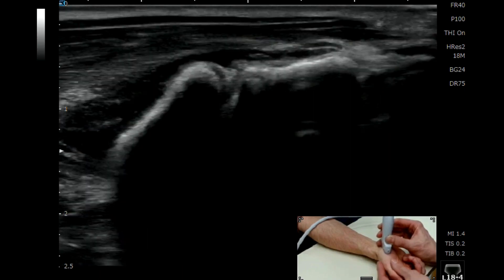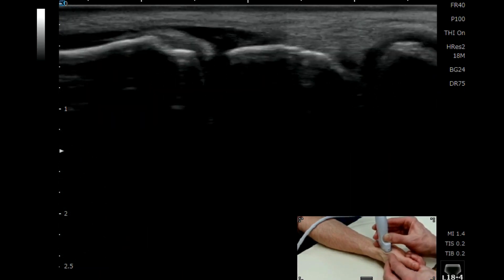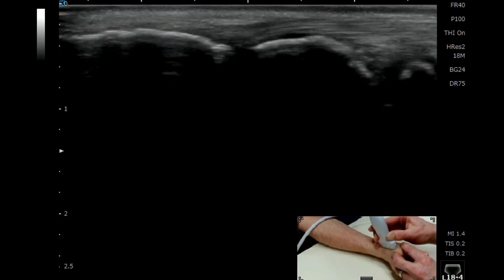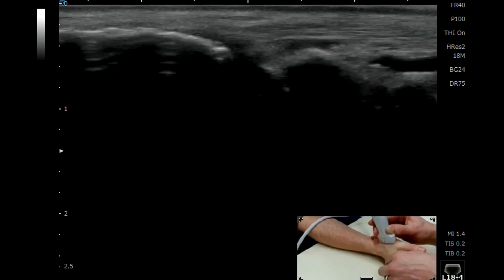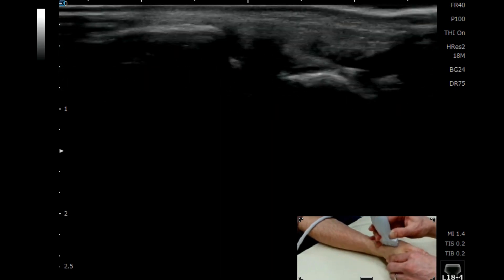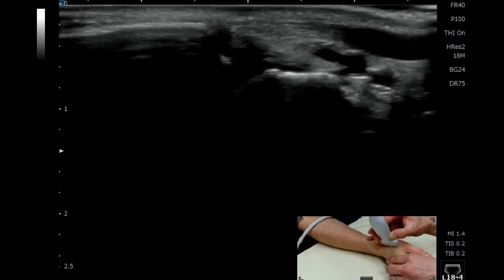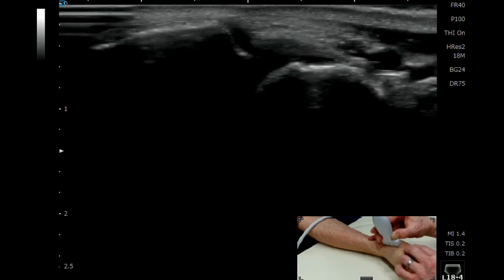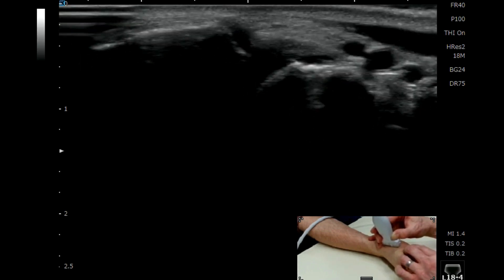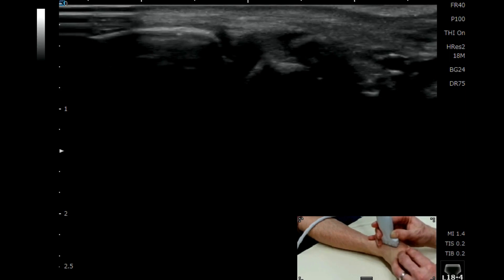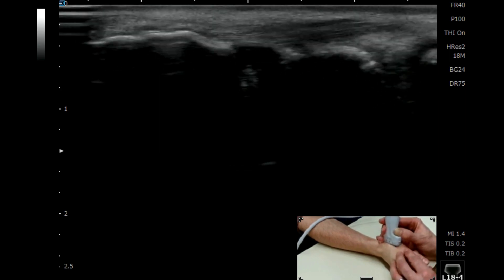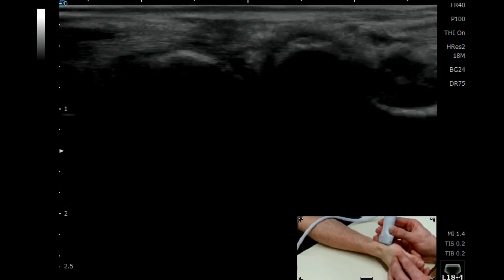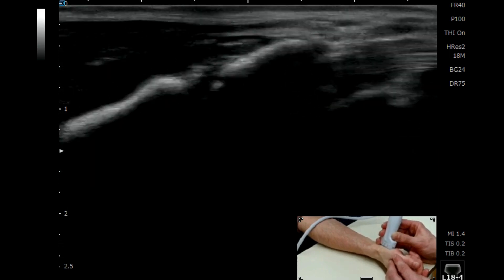If you then go more around to the dorsal aspect — which is traditionally where more guided injections are performed — you don't tend to always see such dramatic pathological change in my experience, but you do still see the recess there very nicely.